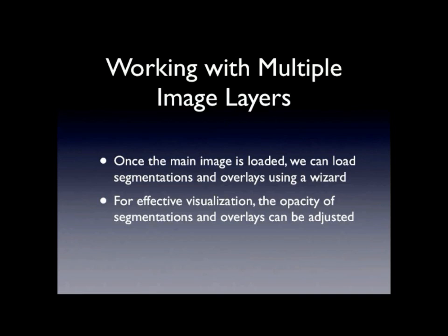Once we load it, in order to visualize it, because we have different layers on top of each other, we need to adjust the opacity of the segmentation, transparency of the segmentation. Otherwise, we're not going to be able to visualize it effectively.